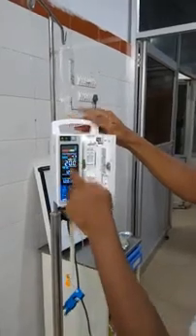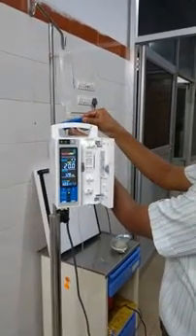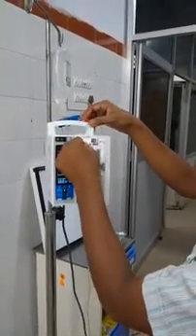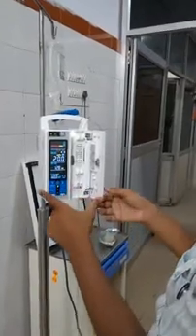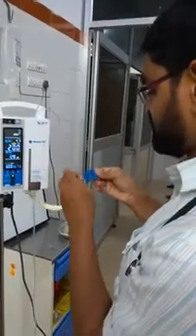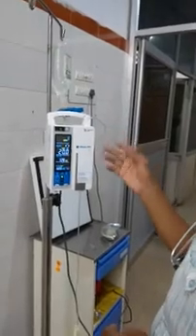The alarm is showing that the sensor is not attached, so I will clamp the sensor back. And then I am done. Again I am forming a loop here, attaching it here, here, here, and I am closing the latch. I can also clean the drop sensor right here. Sometimes even the drip chamber and this tubing, we can clean with spirit. This all will help so that the air bubble will not appear again and again.